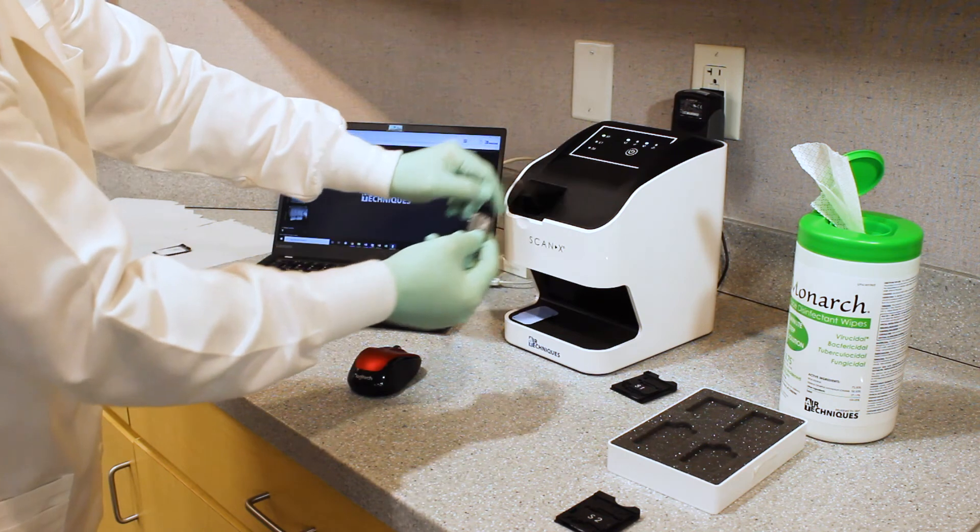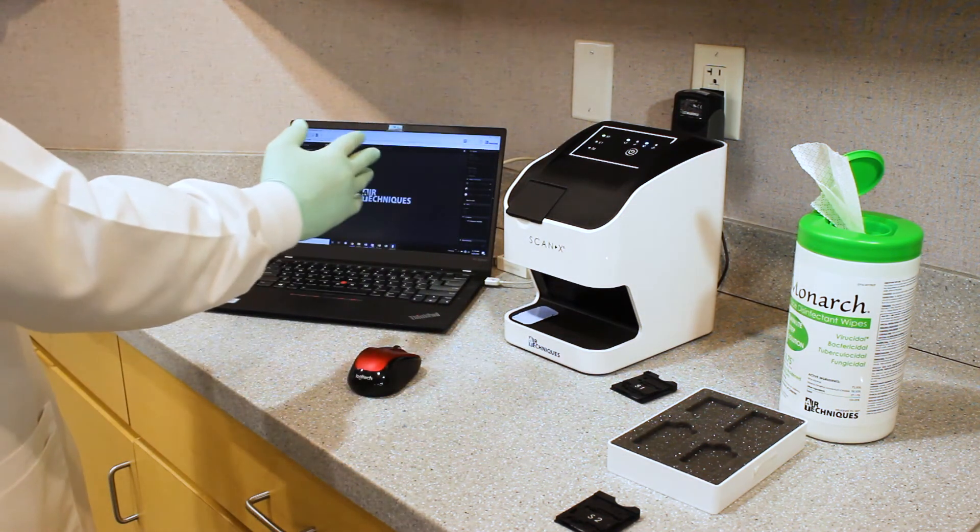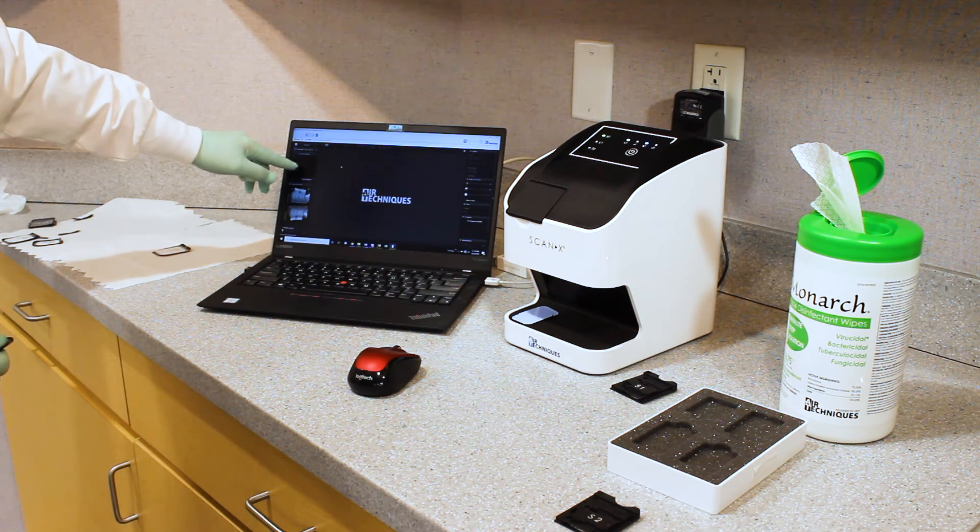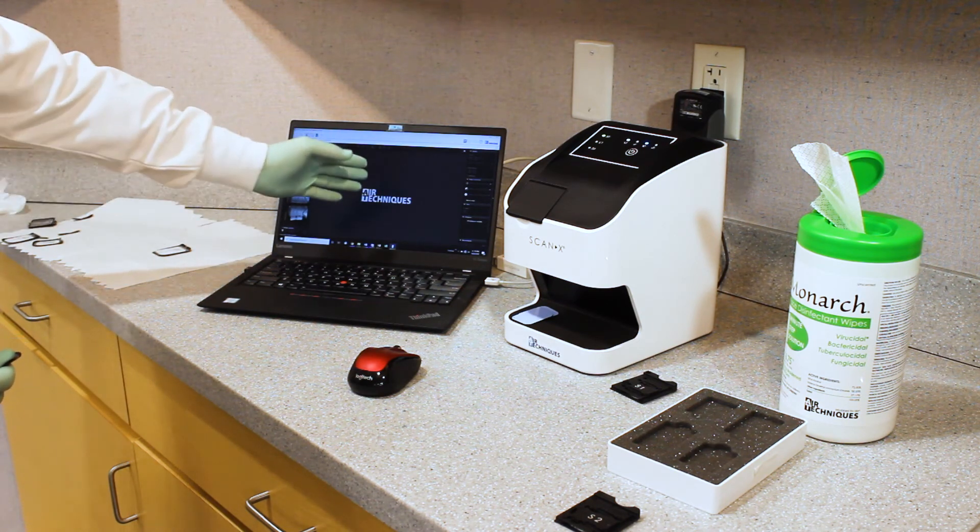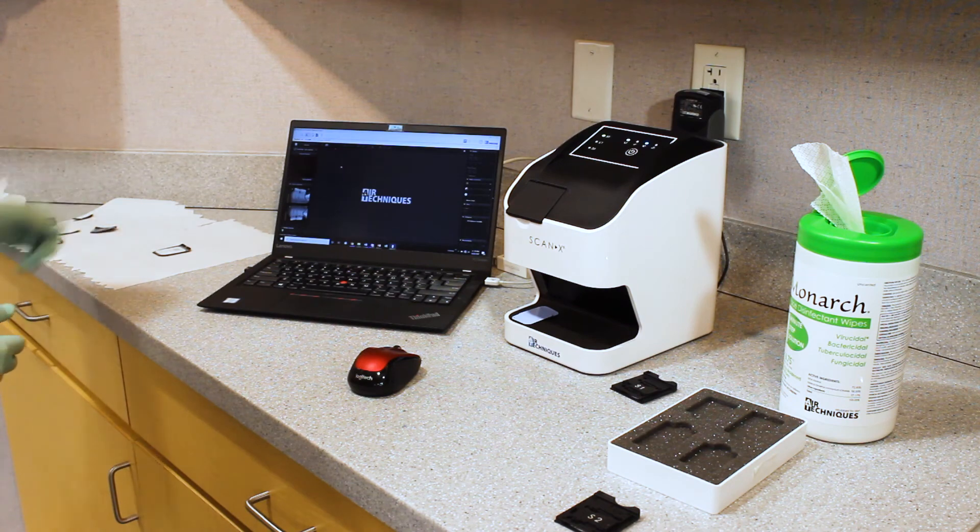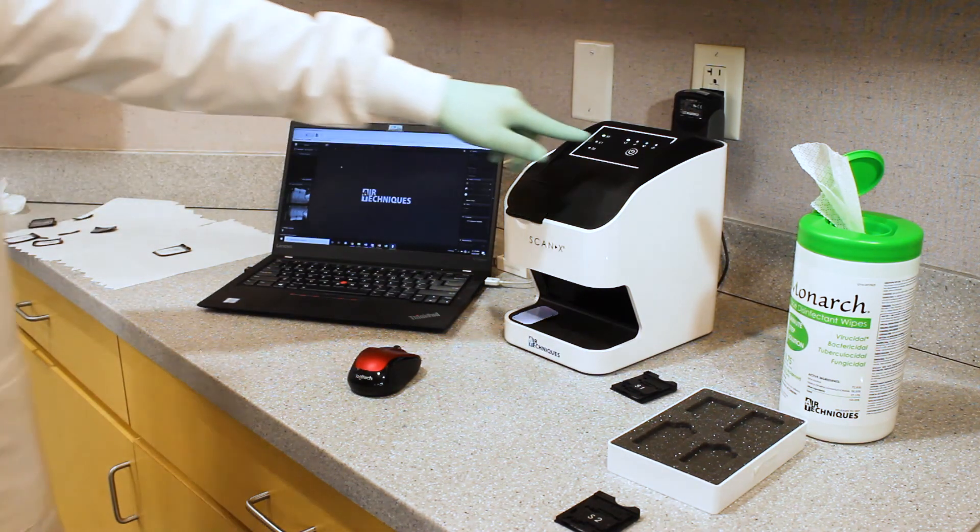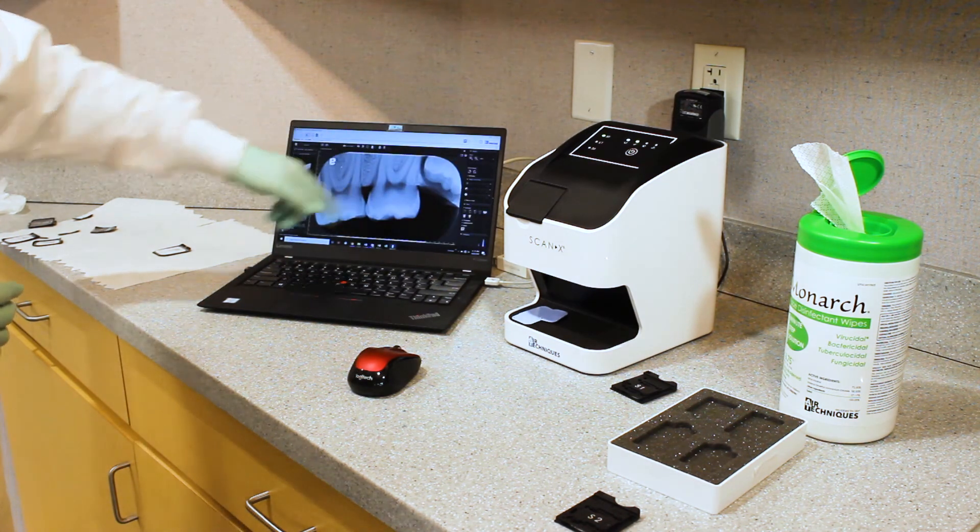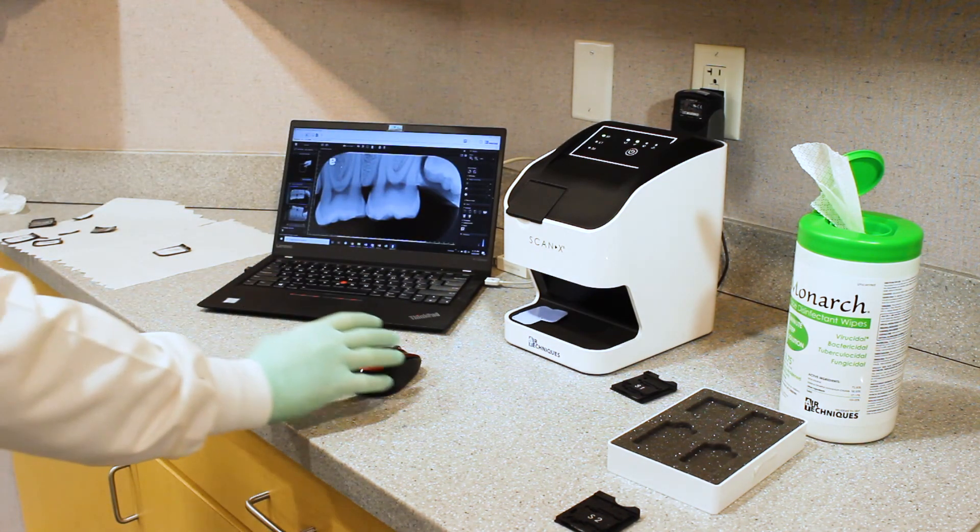While the barrier envelope does not go in, we close the flap. The machine is now scanning that size number zero phosphorus storage plate, as we see over here. And momentarily it will appear on screen. The LED indicators are telling us the status of the machine. So that is our size number zero that has just been acquired.